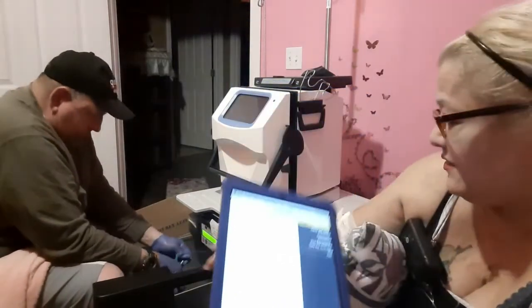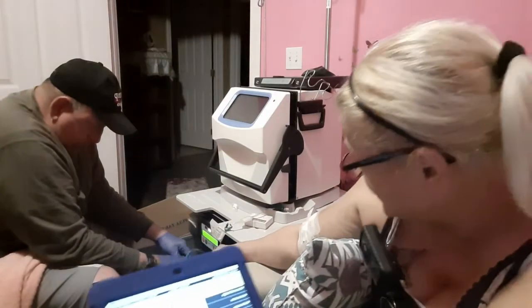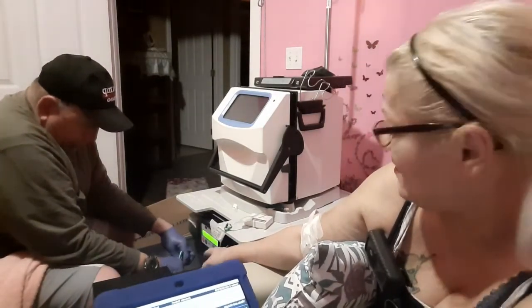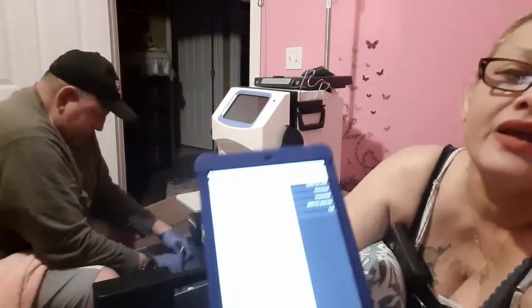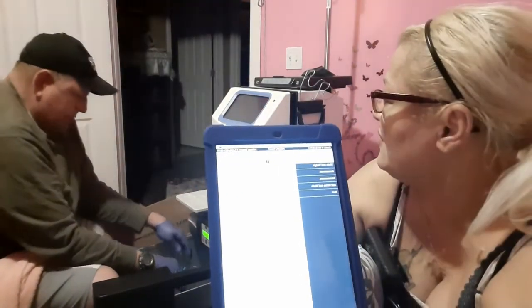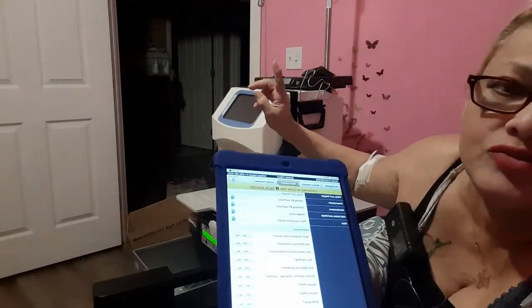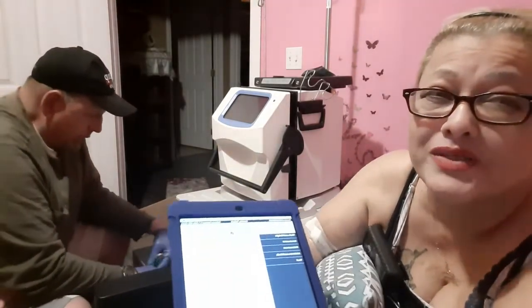Now if we can get the pure flow, what's it saying there? He's trying to put the sack in. It just said open door, load sack. That's what I'm doing. Oh, okay. So he's putting the sack in. I thought it was a fluid leak again. I'm like, I give up. All right, so he's trying to put the sack in on the pure flow so that we don't have to do the hanging bags tomorrow. This is a lot easier because when this bag fills up, I get 3 treatments in 1 bag. So that's less supplies I have to stack up. You know what I'm saying?